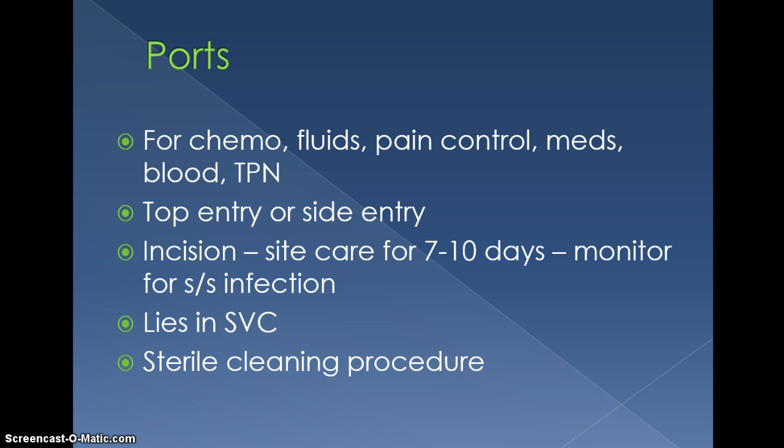Okay, so we talked about ports a little bit again for chemo fluids, pain control meds, blood, TPN. It's either done by a top entry or a side entry to access the port. In the top entry, the needle is inserted perpendicular to the reservoir, and in a side entry, it's inserted almost parallel to the reservoir. The top entry is the most commonly used. I've never even actually seen a side entry for those.